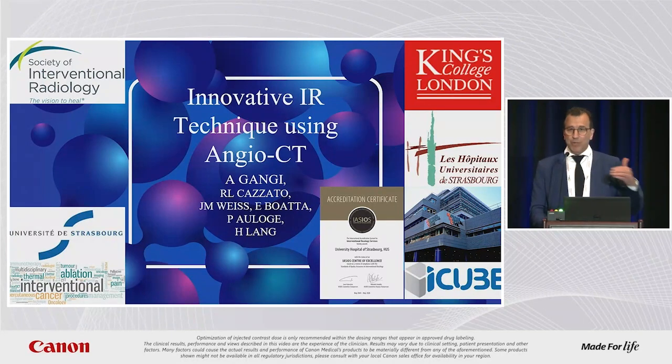It means that at the moment you are putting the patient in a room like this, you have already planned what you will use. Mostly CT, mostly angio, mostly ultrasound. We are planning the patient when we see them in the consultation. We have 3 operating rooms, 1 cone beam on the side. We have 1 Angio-CT and 1 MR.